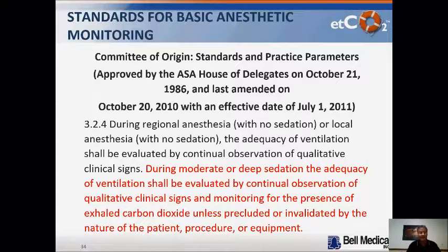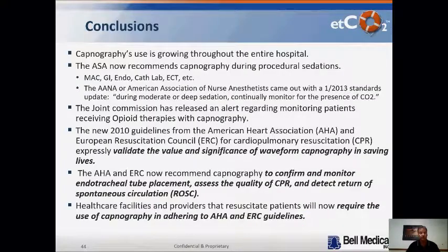But if you're using any kind of sedation, and propofol would be a deep sedation, but any kind of moderate or deep sedation, the adequacy of ventilation shall be evaluated by continual observance of qualitative clinical signs and monitoring for the presence of exhaled carbon dioxide unless precluded by other situations. So basically, since 2011, it's pretty well a standard of care. But you will still find GI departments and various departments that aren't using CO2 routinely.